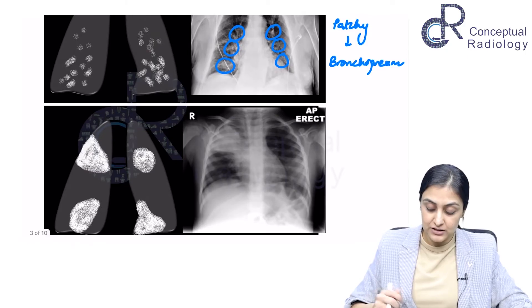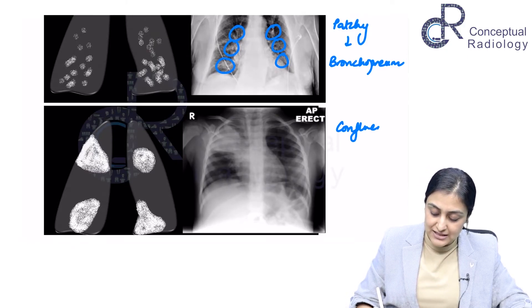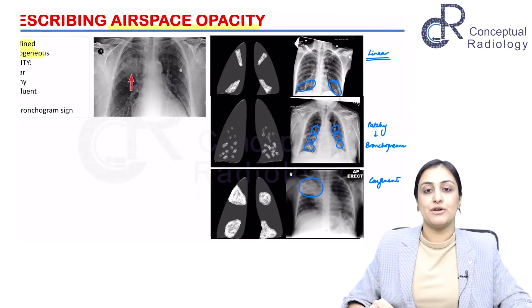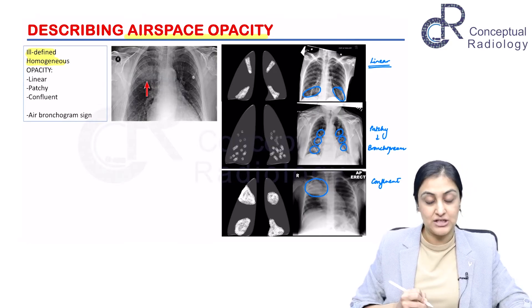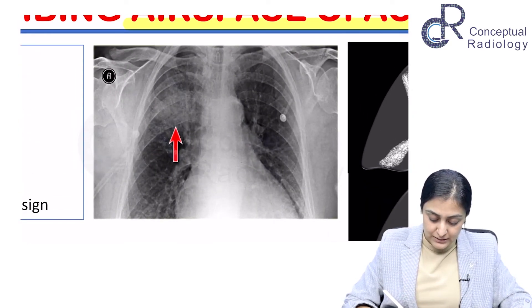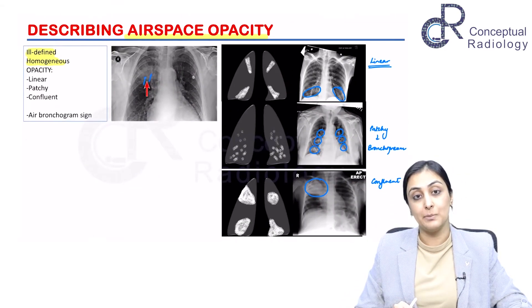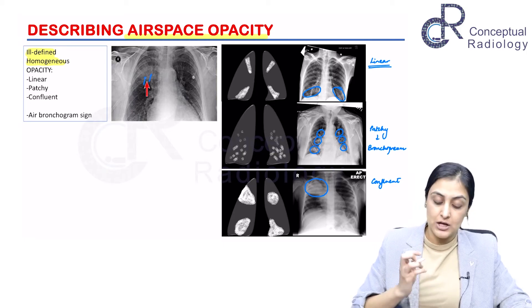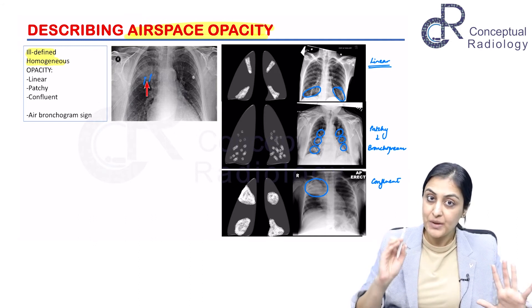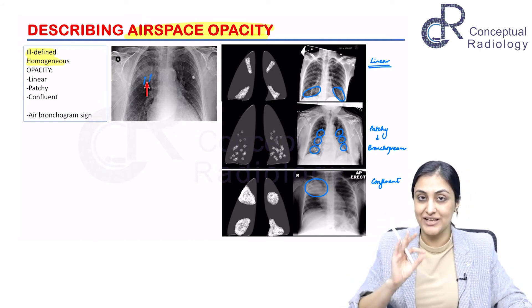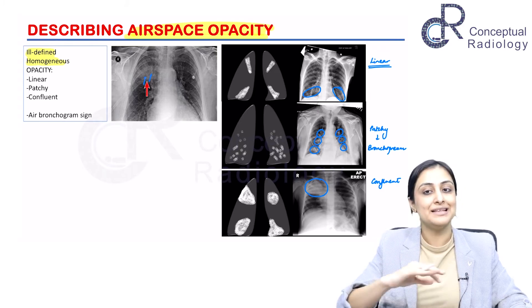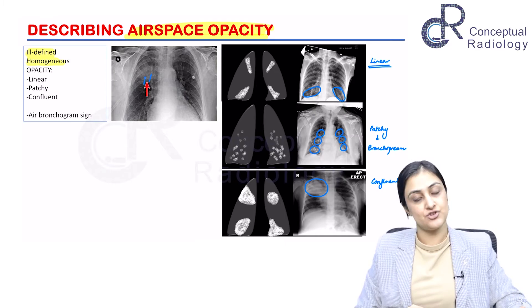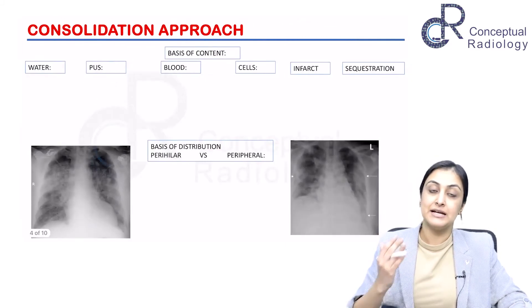Finally, the most typical one is your confluent opacity — linear, patchy, or confluent — where you have these multifocal confluent opacities, as seen here in the right upper zone. If you see the air bronchogram sign — the black bronchi coursing through the opacity — you can comment on it. This further tells you that it is indeed a consolidation. So you describe: ill-defined homogeneous opacity, linear, patchy, or confluent, with air bronchogram sign, and the impression is likely a consolidation.